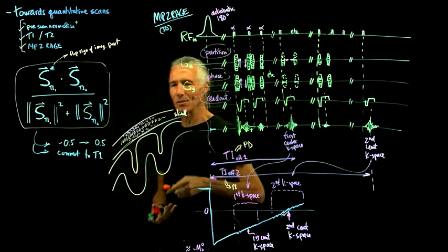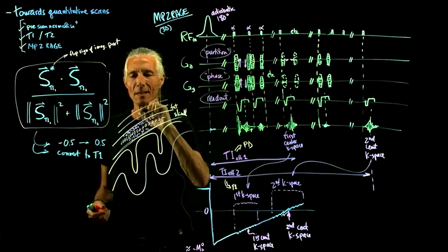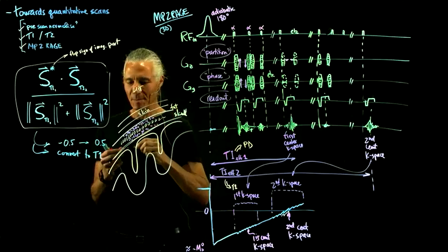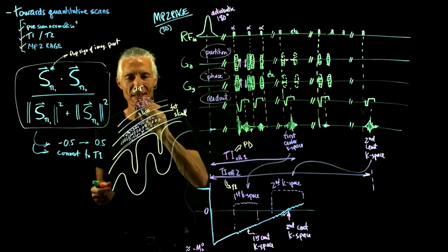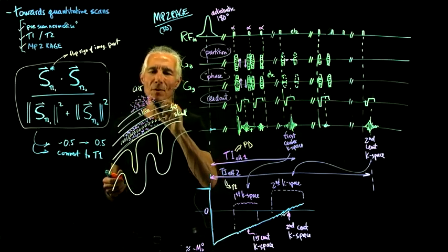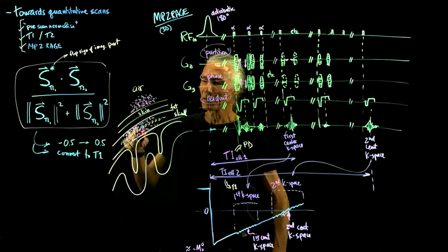And then we get out to the little fat layer. That one's got a signal again, and then we get out to the skin. But when we get out to the air, complete mess. It's just speckled black and white. So if you take an image like this, even though this image is much better, it's much more quantitative, and just feed it into a program that's designed to segment the brain, it's not going to work because there's a bunch of junk in the skull and a bunch of junk out in the air.